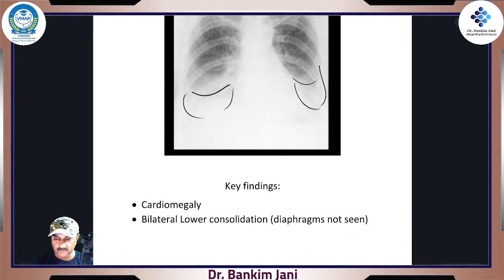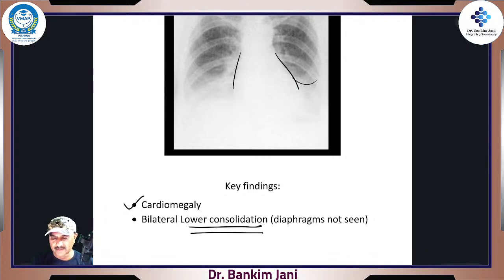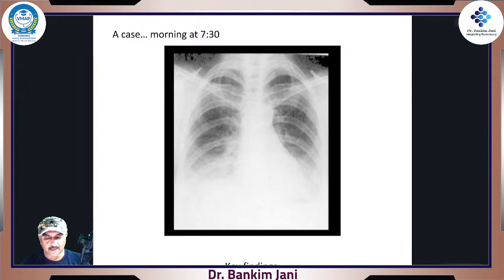And also see the heart. They say you have got cardiomegaly, there is bilateral lower consolidation, right? We cannot see the diaphragm, lower lobes are badly congested. Nothing can be done, right? And this is the thing. He said, okay, the seniors will come, sit.